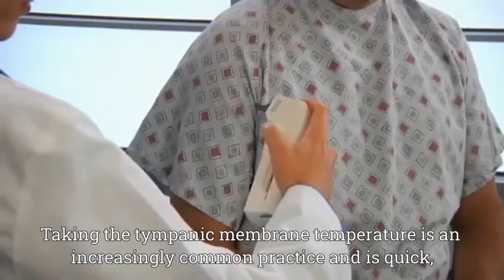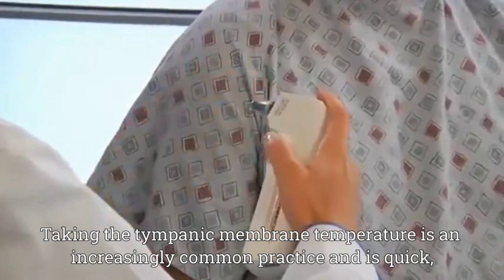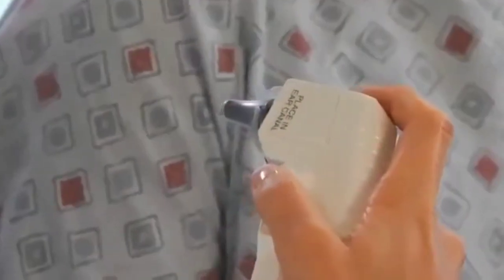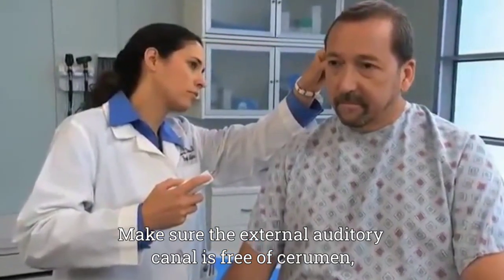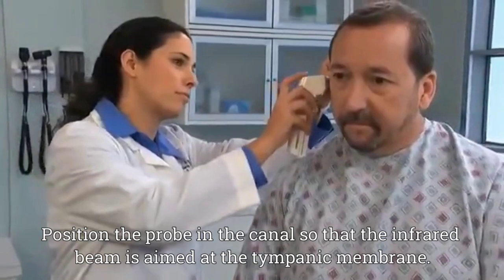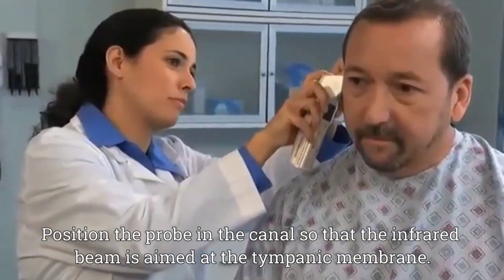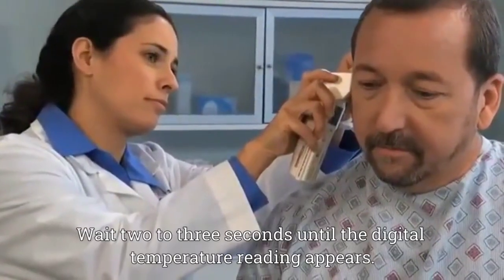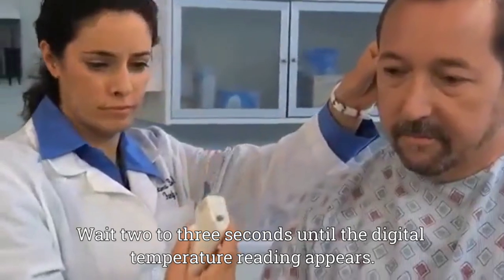Taking the tympanic membrane temperature is an increasingly common practice and is quick, safe, and reliable if performed properly. Make sure the external auditory canal is free of cerumen, which lowers the temperature readings. Position the probe in the canal so that the infrared beam is aimed at the tympanic membrane, otherwise the measurement will be invalid. Wait 2 to 3 seconds until the digital temperature reading appears.